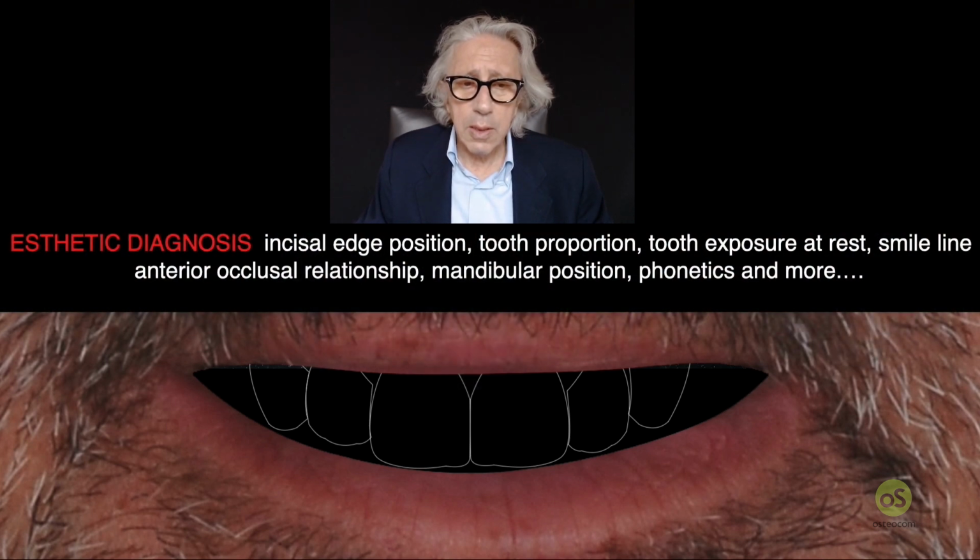Because remember, this will represent the first step in every prosthetic case. The starting point of your aesthetic and functional evaluation starts from the position of the incisal edge. So there are many steps you should follow in order to know where the incisal edge should be.